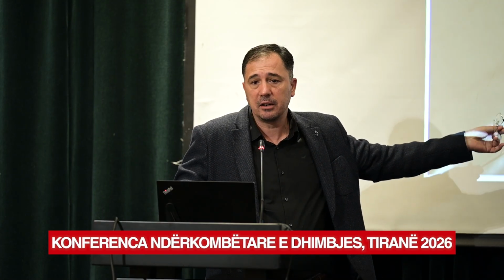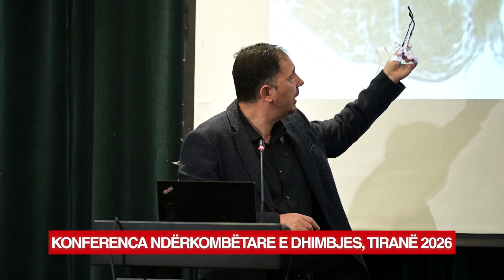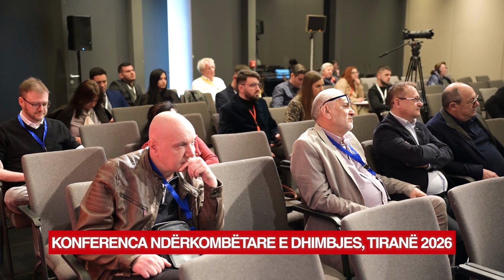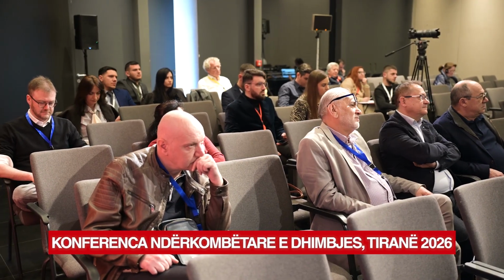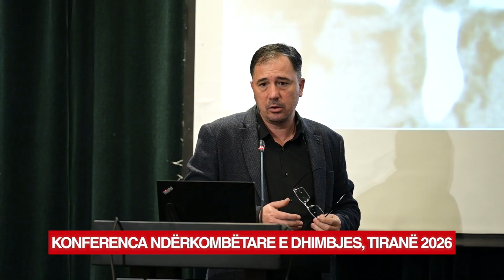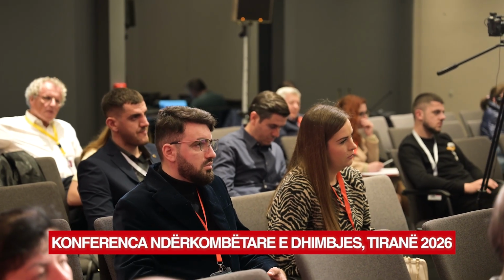And this is another simple case, when we can inject inside the facet. In this case, for diagnosis of a disc hernia in the L4 left nerve root, we can inject easily under CT scan at the origin of the nerve root and inside the epidural space when the diagnosis is made of hypertrophy of the longitudinal ligament.